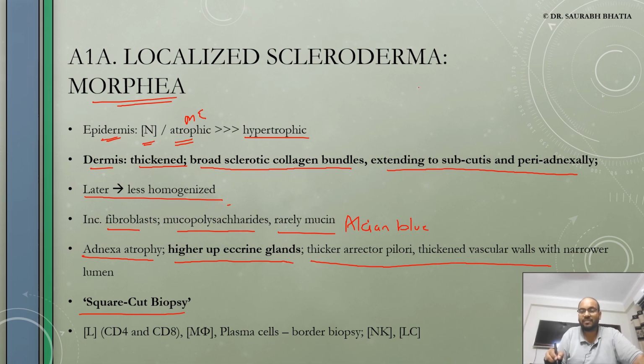But since you are dealing with a sclerosing disorder, a disorder that toughens up and thickens the dermis, the biopsy remains like a square shape, more of a rhombus, but you will get my point. You can see clear 90-degree, perpendicular, sharp corners, and you can clearly make out that here the dermis ends and here the dermis begins. So this whole is dermis.